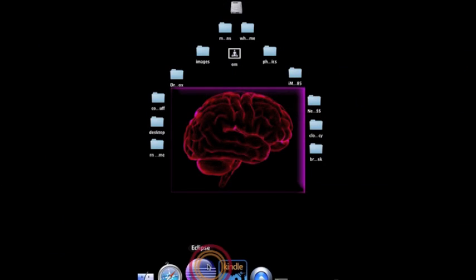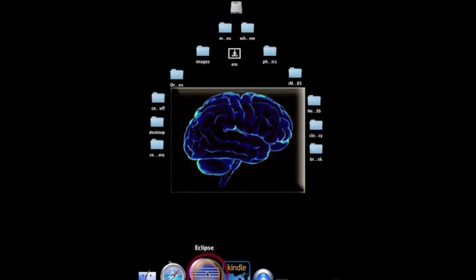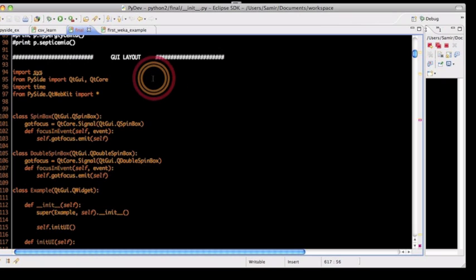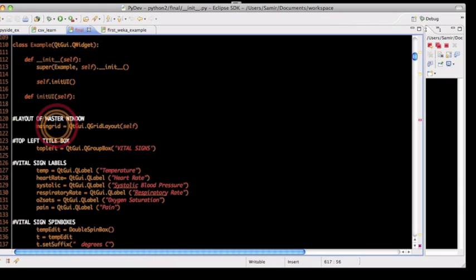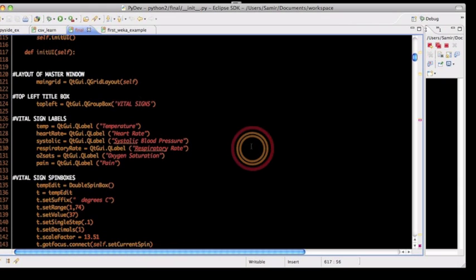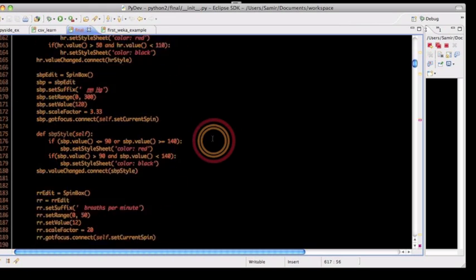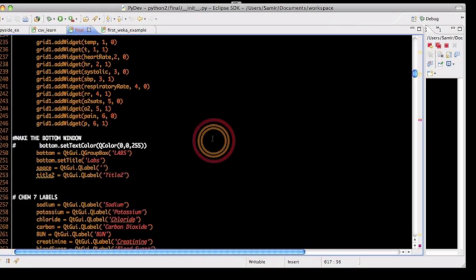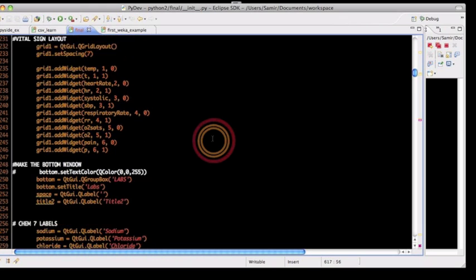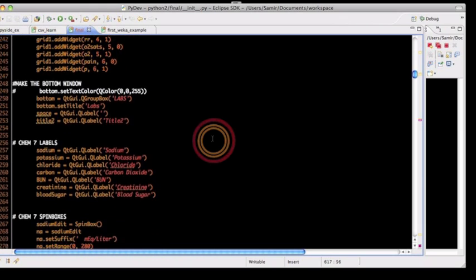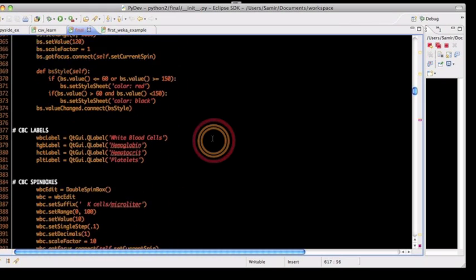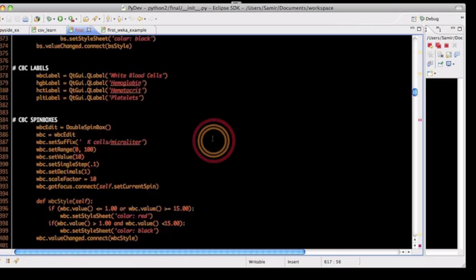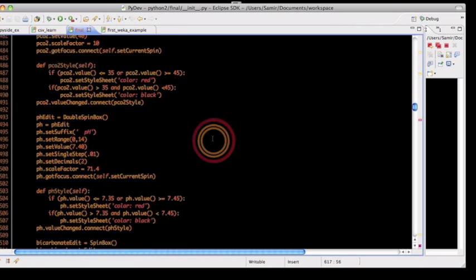My interpreter of choice was Eclipse. I have this program laid out in a couple different sections. The first part is the GUI, Graphical User Interface Layout. I've got a main grid, a top left section of the main grid, which contains my vital sign labels and spin boxes. I have a bottom window that contains CHEM 7 values, complete blood count labels and spin boxes, and arterial blood gas labels and spin boxes.